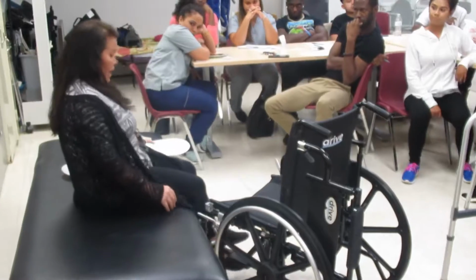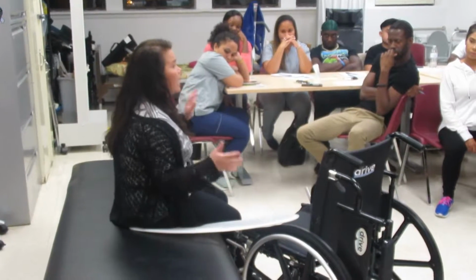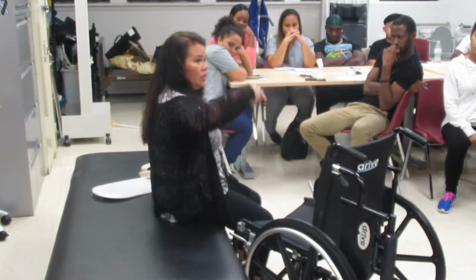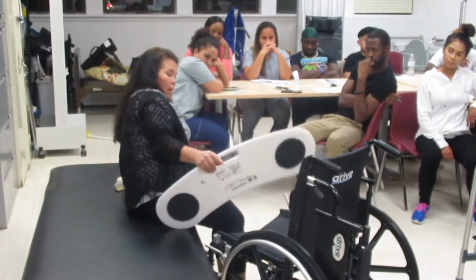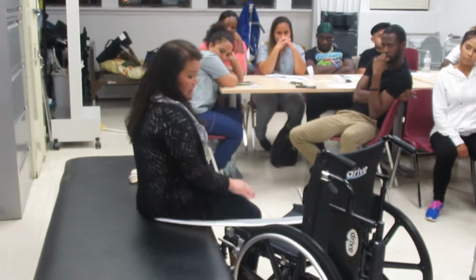They shouldn't be sitting back here and try to do the slide board, because, again, the body mechanics is going to be off, right? So whatever they're doing, it's always scooting to the edge of the surface or the mat. Offset their weight, lean over, place it underneath. It's got to be underneath the butt cheeks. If it's not enough, they're going to slide right off.